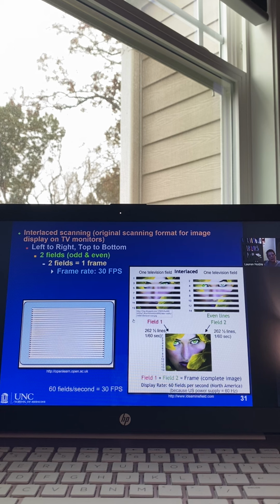Okay. So when you look at the monitor, this is happening rather quickly though in terms of how it is displaying it. That we don't see this. We don't see this happening. All we end up seeing is that final product, that final image.